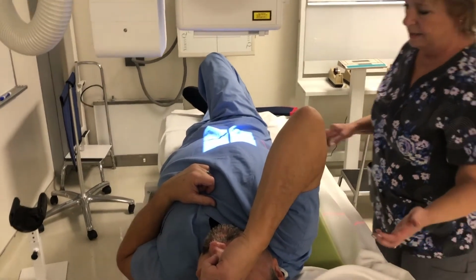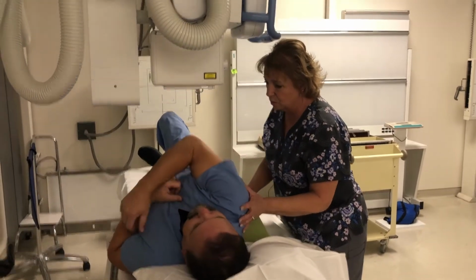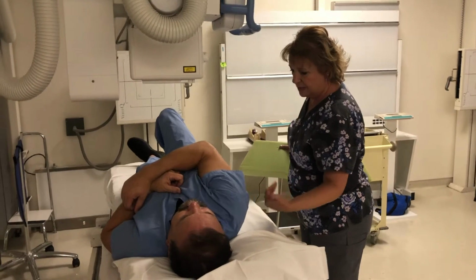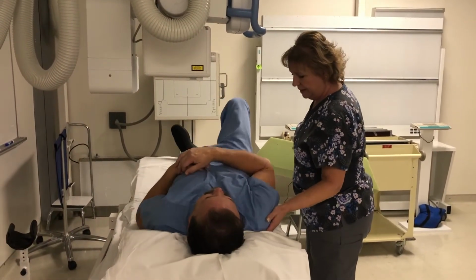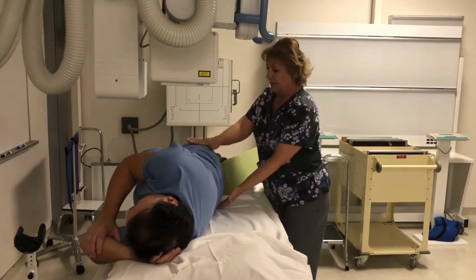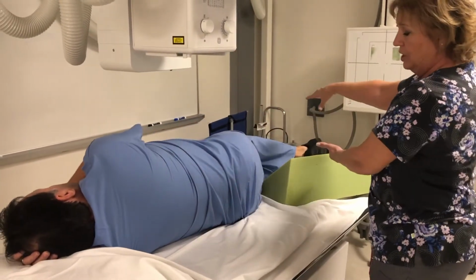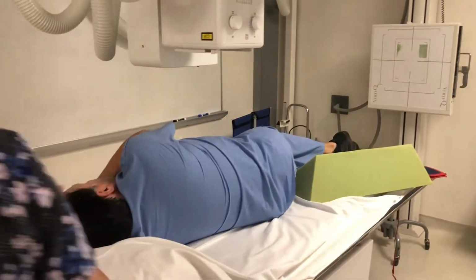All right, now I'm going to take this sponge out and I want you to slide back toward me just a little bit on the table so that you're not so close to the edge. So slide toward me. Okay, a little bit more. All right, now turn all the way up onto your left side. Now I want his hips, knees, and shoulders to all be on top of each other and his hips and shoulders in the same coronal plane.